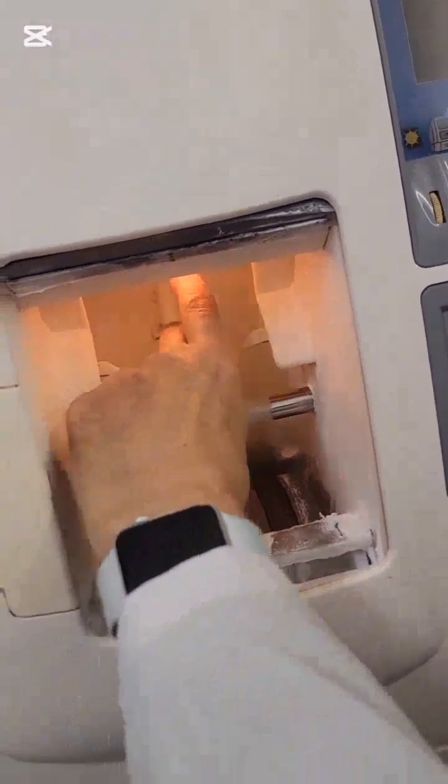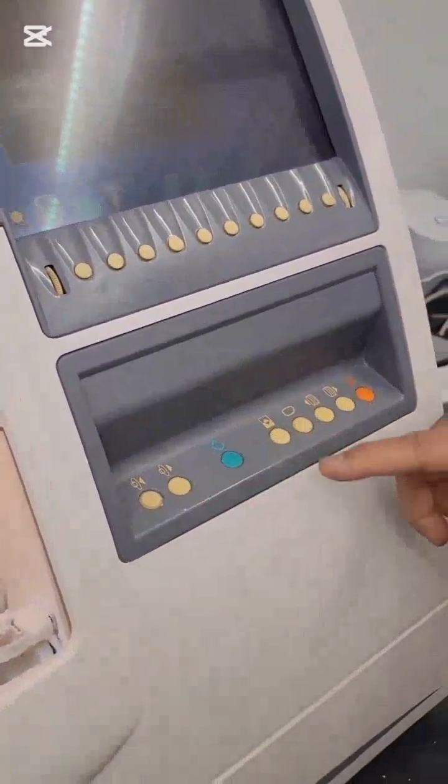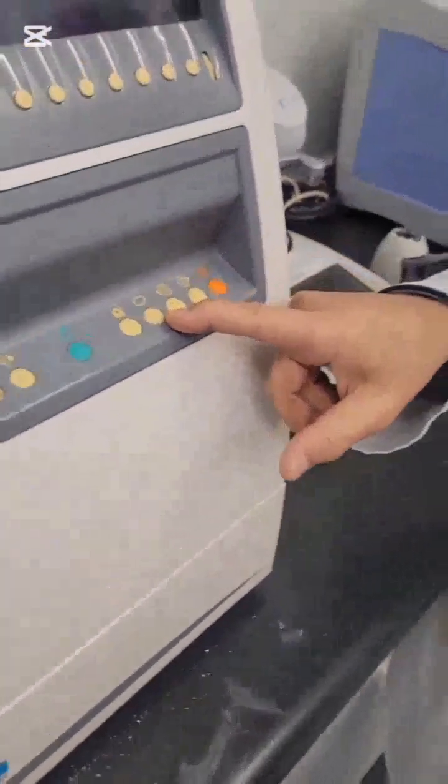Left side arrow button is used to close the chuck. Hold the lens while closing the chuck so it doesn't fall below. The right arrow button is used to open the chuck, and we have to hold the lens with one hand when we open so it does not fall down. This button is to start edging, and this button is for re-edging. After the edging is finished, make sure to do feathering of lenses and make sure the edging chamber is cleaned by spraying water.